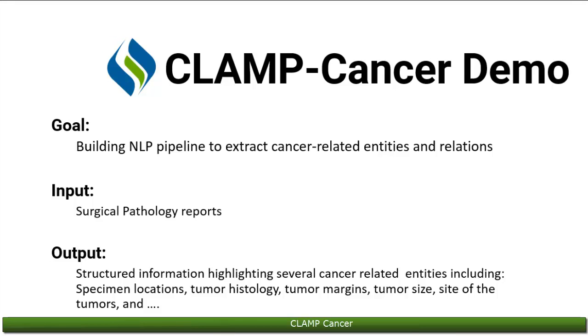Hi everyone. In this video, we will demonstrate how to use CLAMP cancer on pathology reports for patients with cancer. Using CLAMP cancer, you will be able to extract cancer-related attributes from pathology reports.